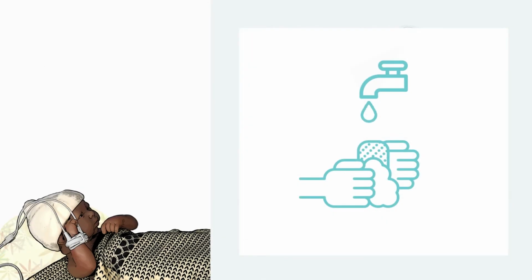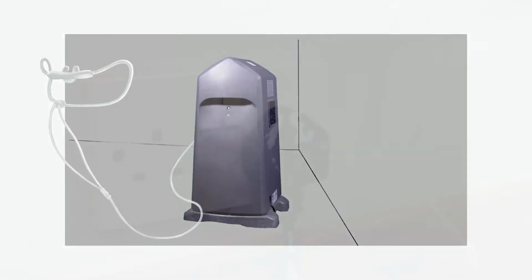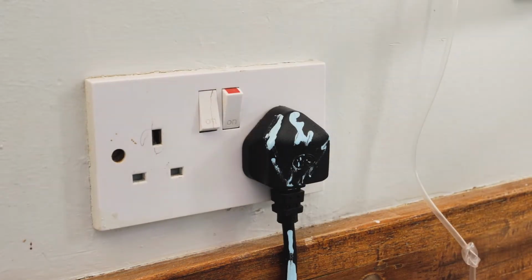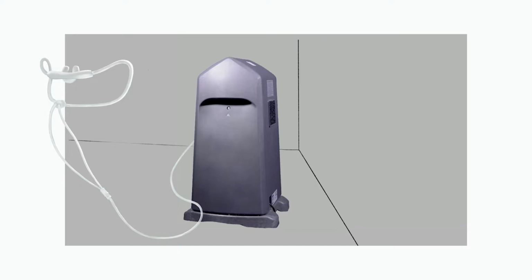Before putting a baby onto the concentrator, wash or sterilize your hands and put on gloves if needed. First, plug the concentrator in. It uses a lot of power, so it should be plugged directly into the wall and not into an extension lead. Remember, the concentrator sucks in air to produce oxygen, so it is really important that it is not close to a wall. There needs to be at least 30 centimeters or 12 inches of space.